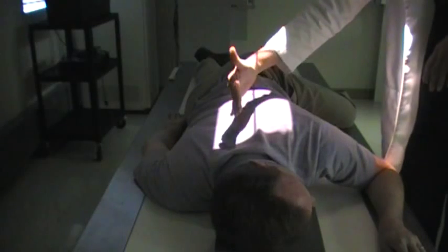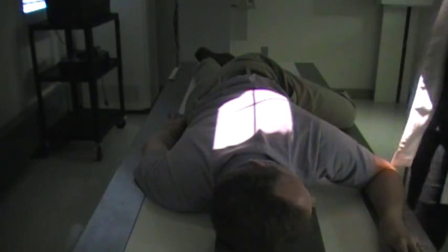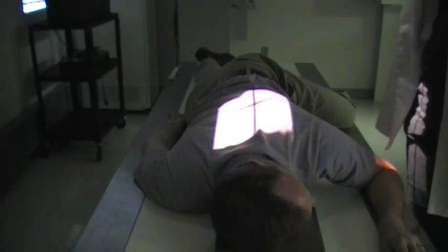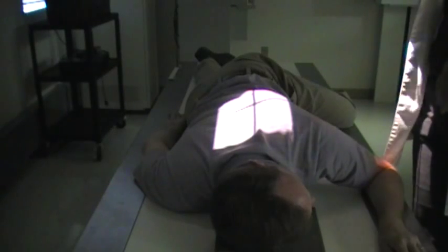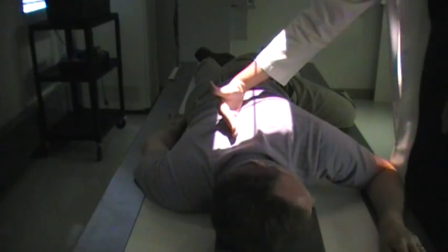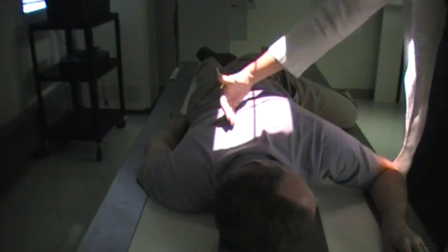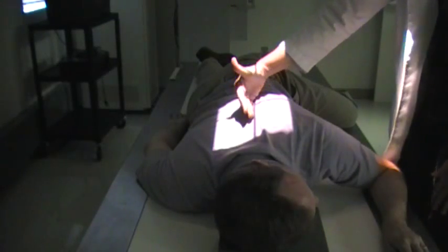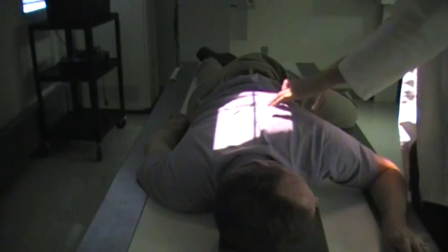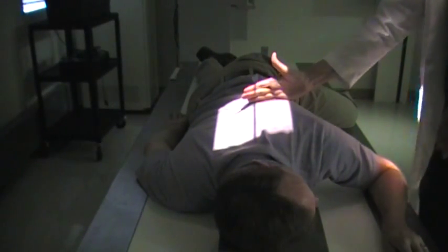And what this does is it projects the sternum out from the midline of the body so that you can see it projected with the heart as a backdrop for the image. So palpate for the spine, and our longitudinal line is going to be 1 inch on the upside, or 1 inch out laterally. Our transverse line is going to cut across the tip of the scapula.